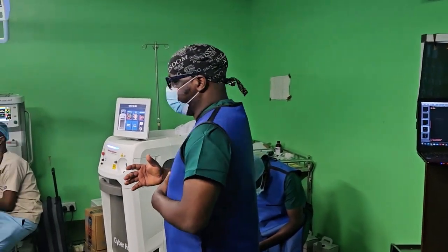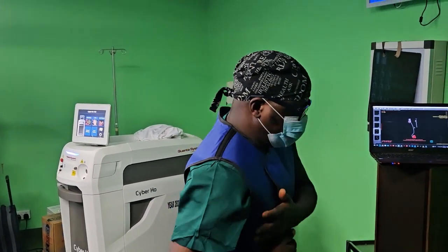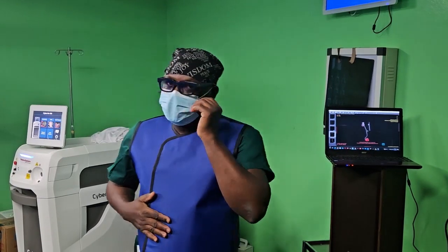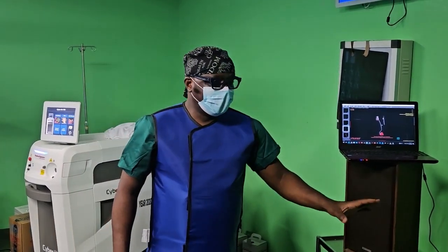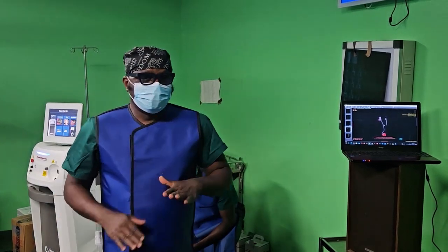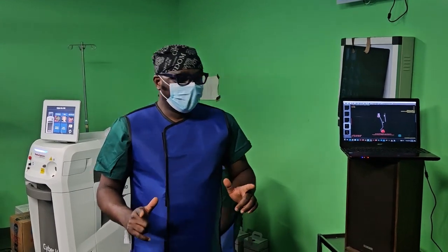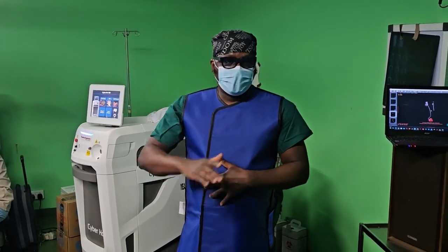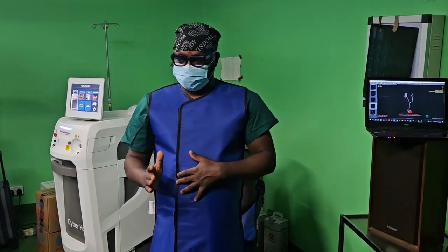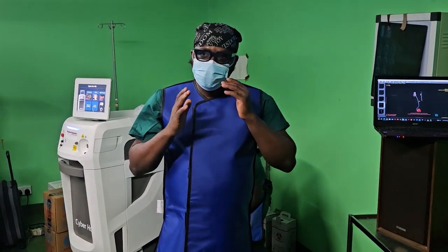Can you tell us the choice of the procedure? Why did you choose a mini PCNL or a combined procedure? So mini PCNL, all the guidelines, AUA, EAU, they are unequivocal about the choice of PCNL as the first line treatment for any stone above 2 centimeters. That is true.